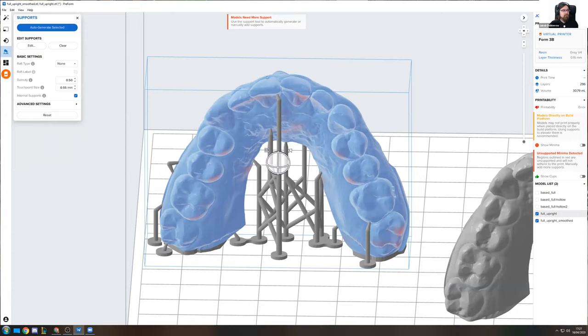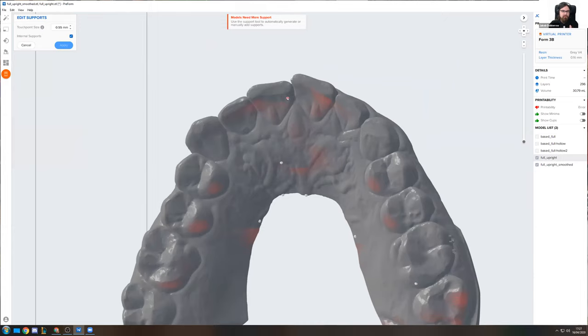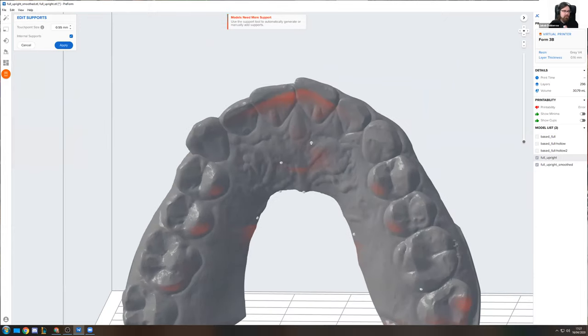So basically, typically speaking, these red shaded areas mean, hey, be careful, this is an area that is not well supported. So this red shaded area here is not well supported. So I don't even want there to be an under-supported or not well-supported area at all. So in order to get that out of there, I have to stop it from even becoming a red-shaded area. So I have to put a support in before in terms of time, right? So I support this area before it even becomes red.